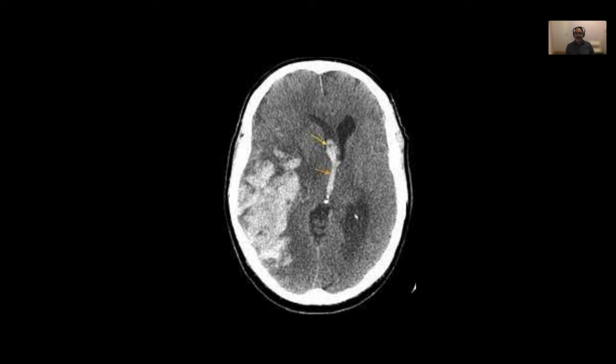And this is... It's also bled into the ventricles. But this is also blood. It is not subdural. It is intracerebral, absolutely. It is intracerebral. And yes, there's a midline shift, and so this bleeding is causing the brain to shift to the side also.